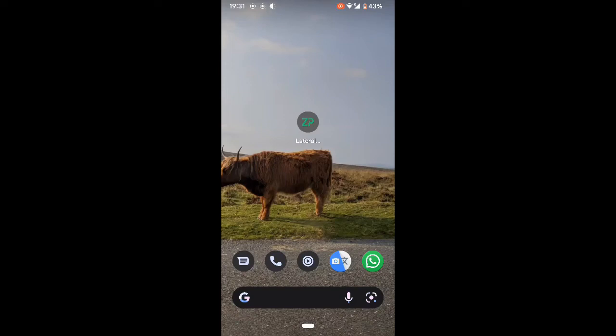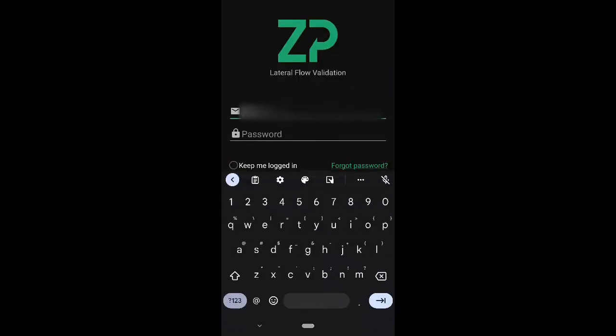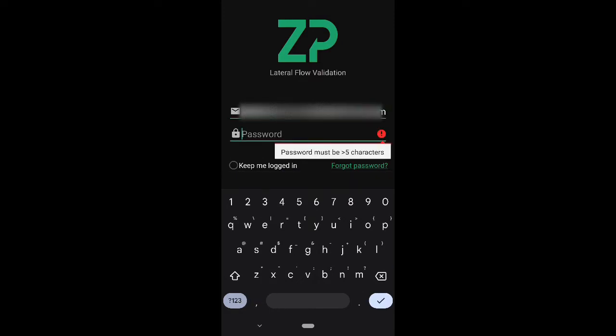Hi, this is a demonstration of the Lateral Flow Validation App from Zimmer and Peacock. First, you'll want to either log in or sign up using your email.